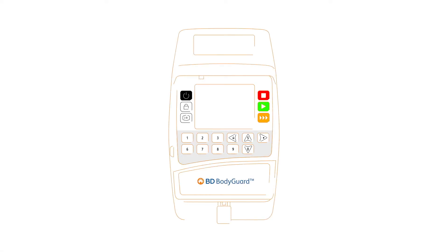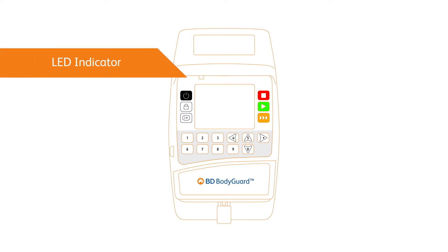The BD Bodyguard infusion pump's interface includes status displays and quick keys to navigate the different types of infusion. The LED indicator illuminates to reflect the different statuses of the pump. Solid yellow indicates a low priority alert or the pump is in standby.